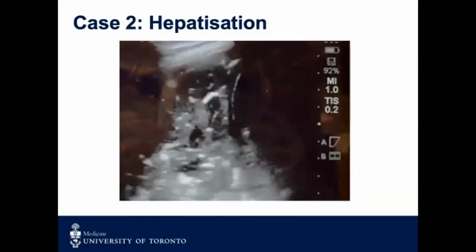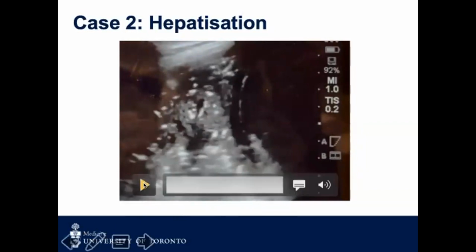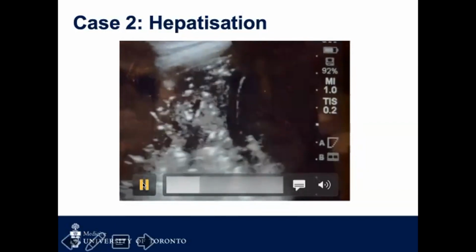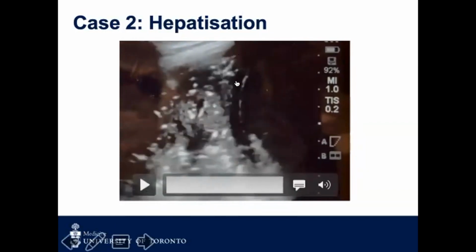We previously talked about how a lot of lung ultrasound is actually artifact. Well, here the lung is so consolidated that you actually end up seeing lung architecture. Just to orient you, here's your diaphragm, here's your pleura, and then you see your lung here. It's not showing up on this computer as well as it is on my laptop, but this is the shred sign.